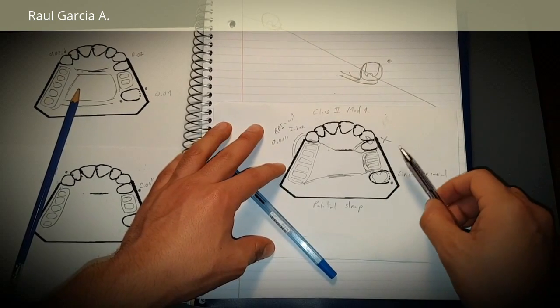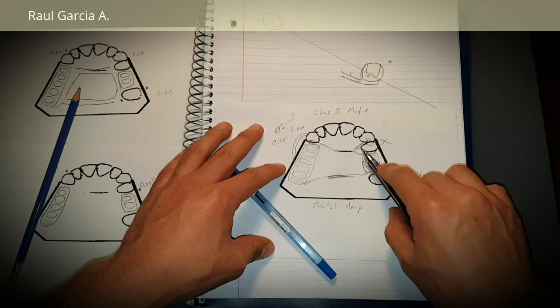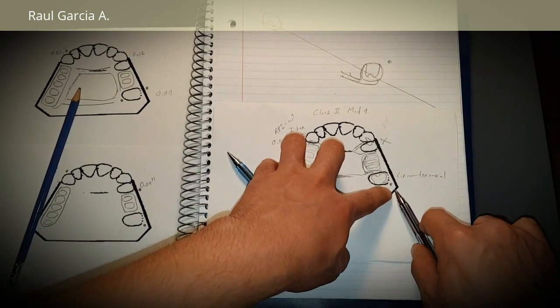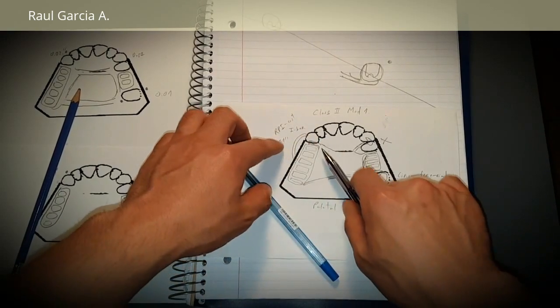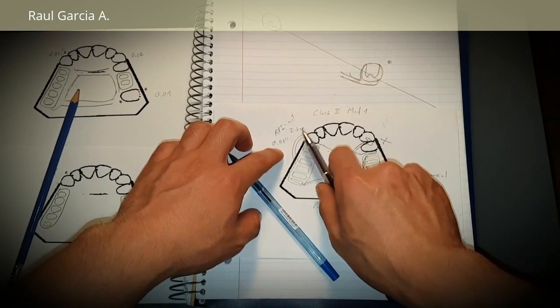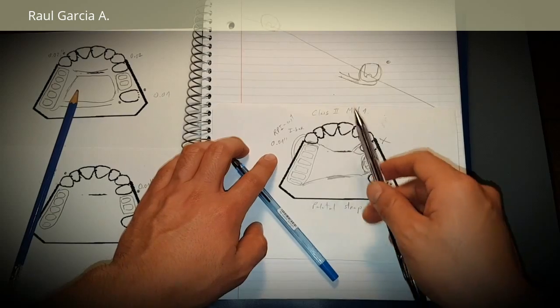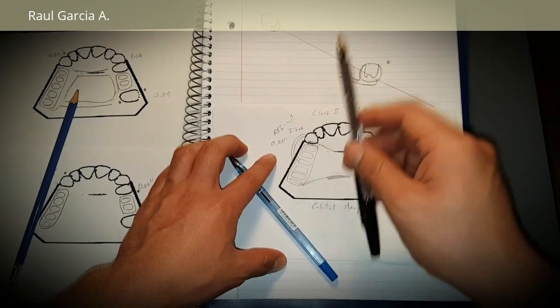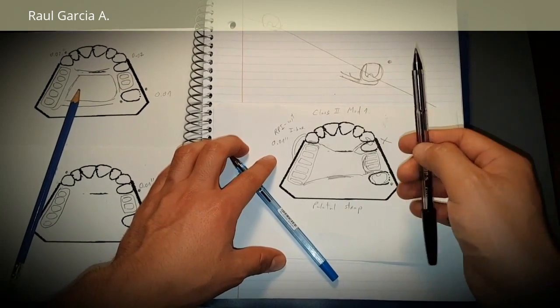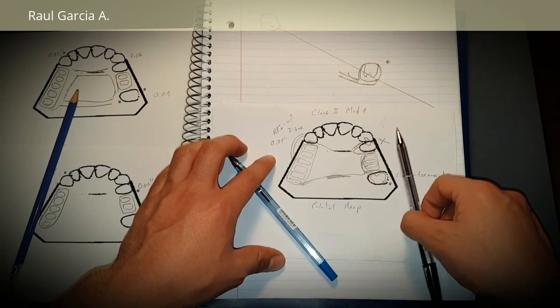So in this case, I'm telling you, you don't have an undercut, neither in the buccal nor in the lingual of the premolar. You have a distobuccal undercut in the molar, and you have a mid-facial undercut of 0.01 in the buccal. So remember, 0.01 inches of undercut is for cast, 0.02 inches is for wrought wire, okay? Which is more flexible, so it needs a deeper undercut.